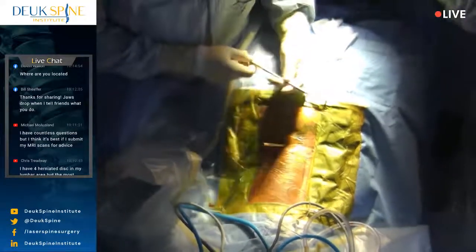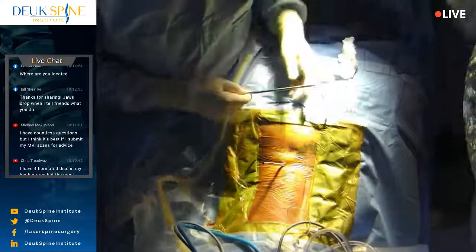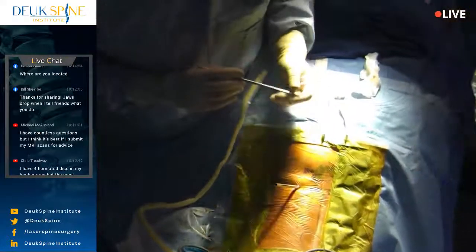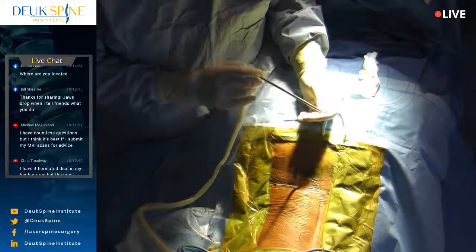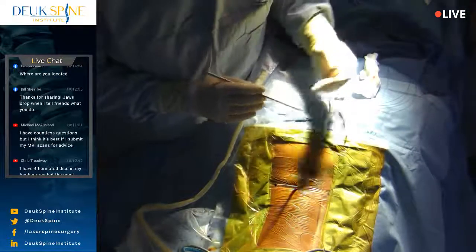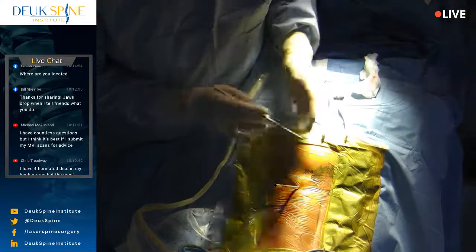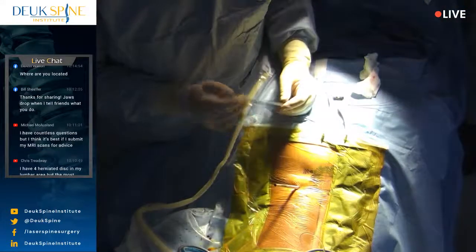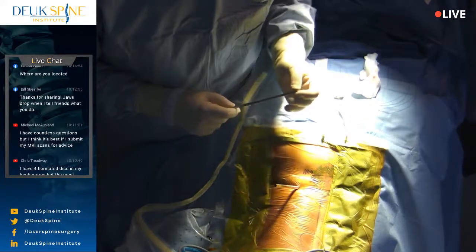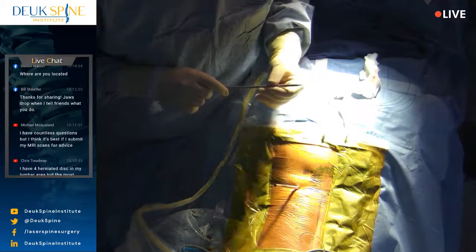All right, so can you see this? You want the lights on, Diego? It's fine, we can see. You guys can see it good? Yes, we can see. All right, so remember, this is called the dilator. I didn't create it. I didn't invent it. It's been used for probably 50 years for endoscopic surgery, but not on the spine, but endoscopic surgery elsewhere. What a dilator does, it literally opens tissues up. By pushing it through, it spreads the tissues around it.